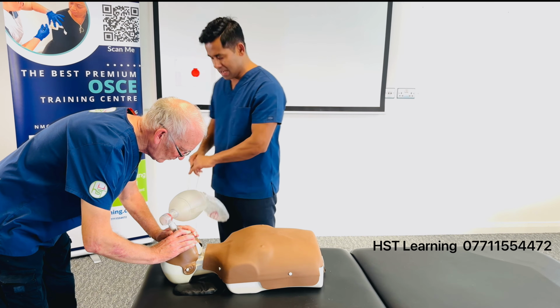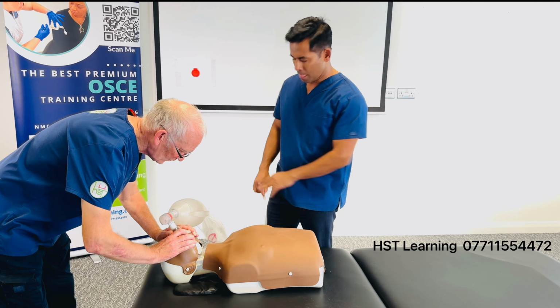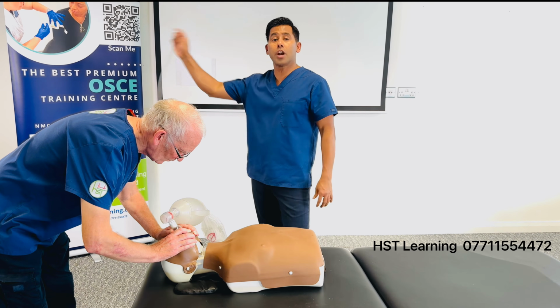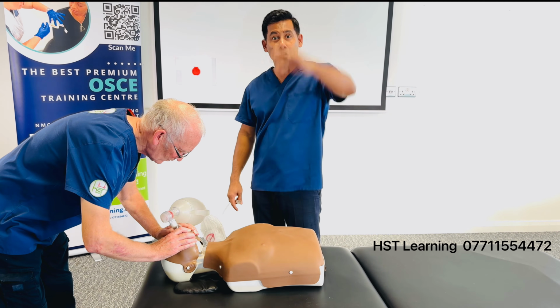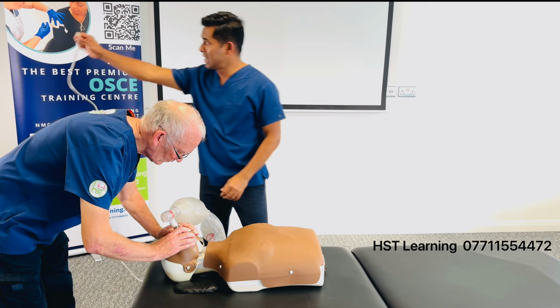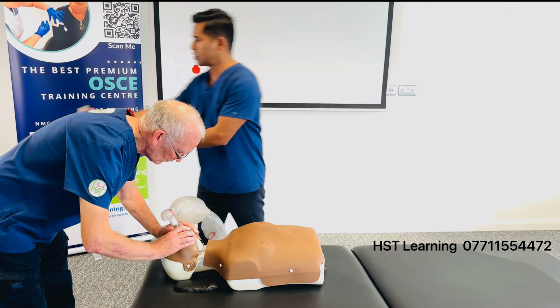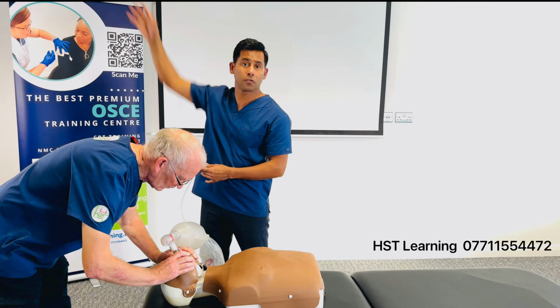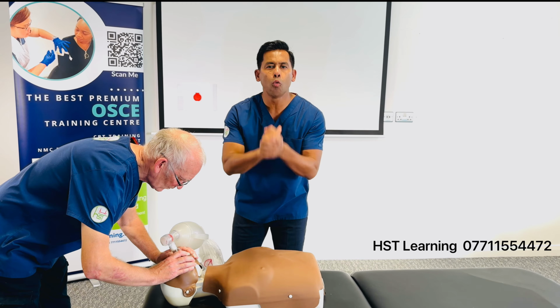My responsibility here, and a common error, is forgetting to verbalize connecting the oxygen. What's the level of oxygen I need to verbalize? It's always 100%. What's 100% on the flow meter? It's 15 liters. The small balloon in the flow meter has to be all the way on the top. So verbalize 15 liters. If there is a flow meter, connect it. Do not pretend that it's connected. For the exam situation, you just verbalize that I'm going to put it on 15 liters of oxygen, which is 100%. And I'm going to give 2 ventilations, 1 over each second.